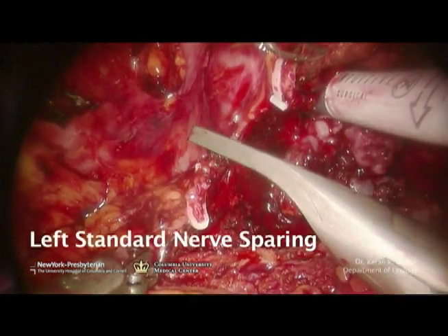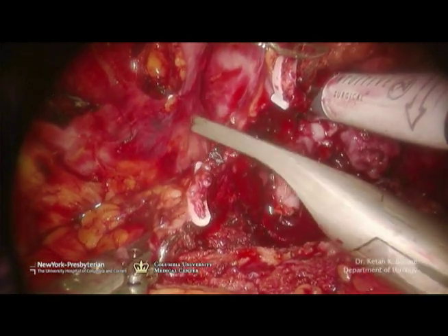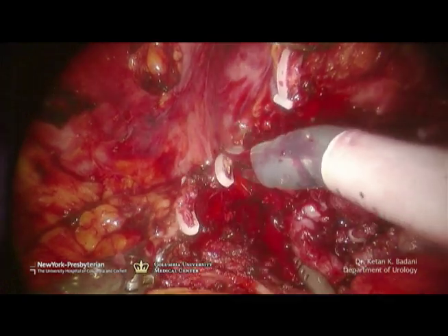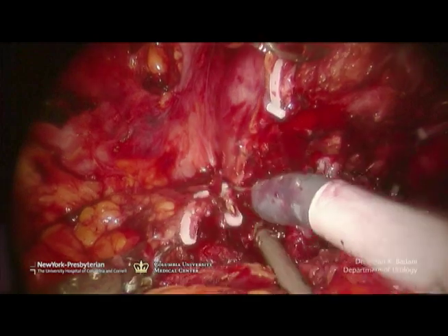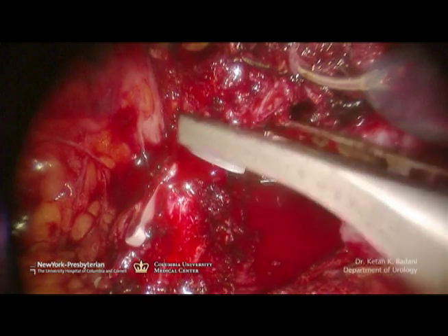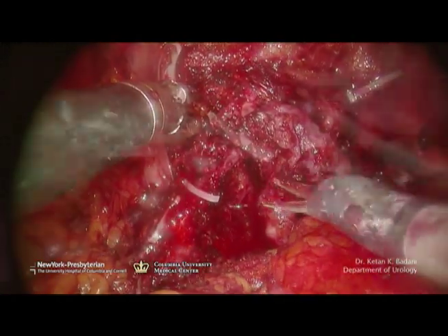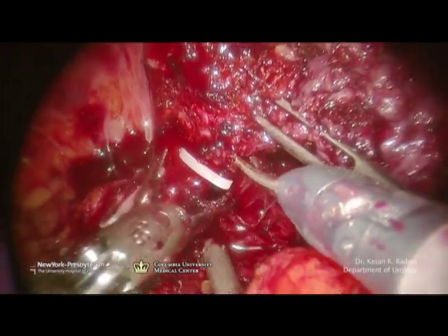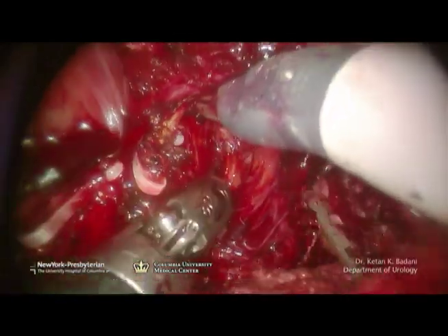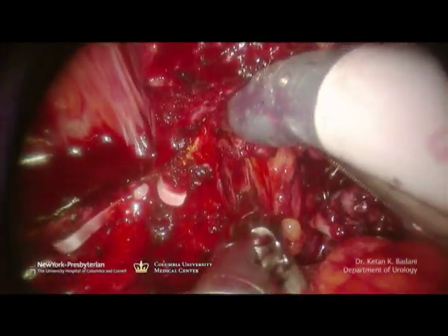The left-sided nerve sparing: the hemo-lock clip is precisely placed at the pedicle of the prostate and divided. My fourth arm is giving me counter-traction on the bundle, and my assistant is giving me upward traction with his grasper. The pedicle is divided, and the same plane between prostatic capsule and bundle is found. The rest of this fibrotic tissue from the posterior dissection is now gently freed up.